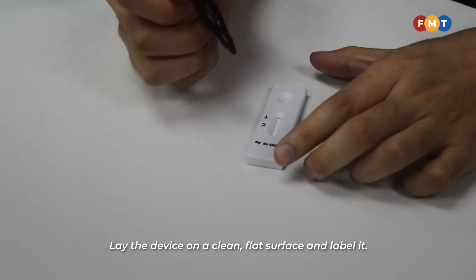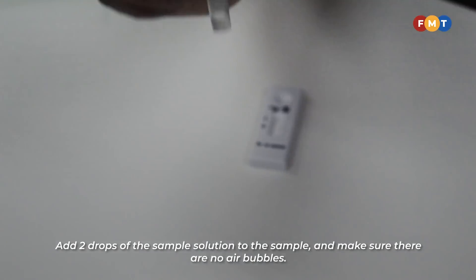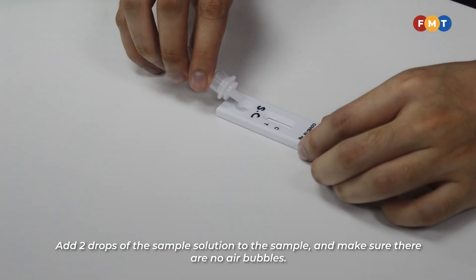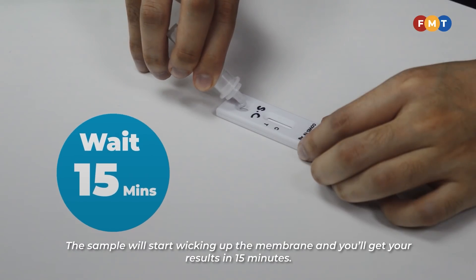Lay the device on a clean, flat surface and label it. Add two drops of the sample solution to the sample well and make sure there are no air bubbles. The sample will start activating the membrane, and you will get your results in 15 minutes.